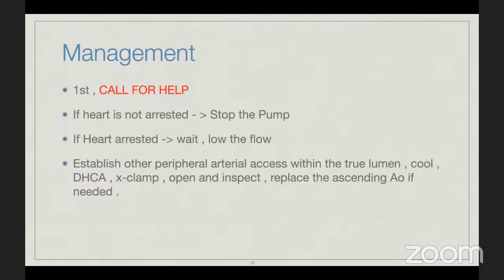If it happened right away after the cannulation, then you didn't start the pump yet. So just switch right away. Keep the cannula. Do not move it. Do not remove it. Keep it in place. Go and open the groin and establish the bypass from there, and then cool the patient. Relax, cool the patient. That's number one.